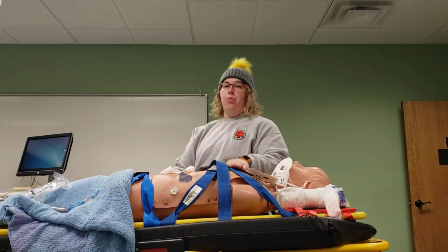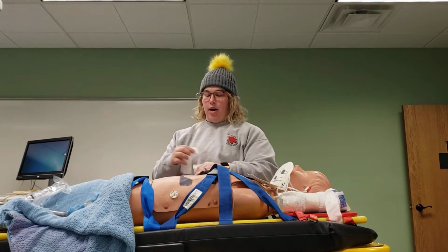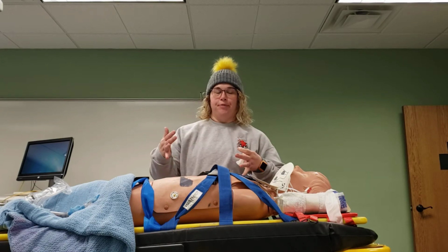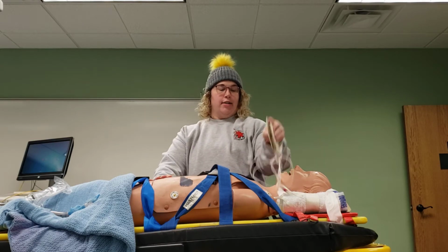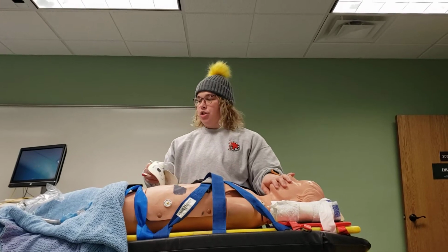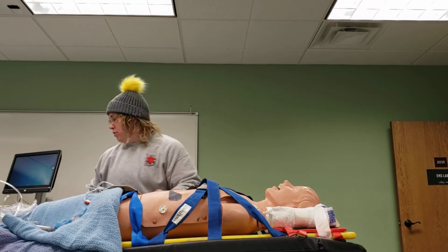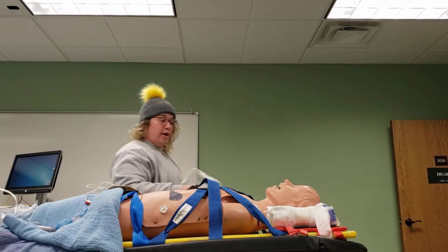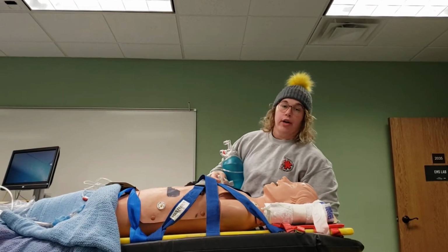We're going to kind of mix two practices in with this one. We're going from very basic airway management to cardiac arrest, because those two will intertwine with one another. With any question of someone who's, let's say, in respiratory arrest, you don't want to just use these devices. You want to use a BVM because they're not going to be breathing independently. So if you don't force the air in, then very little air is going to get in.